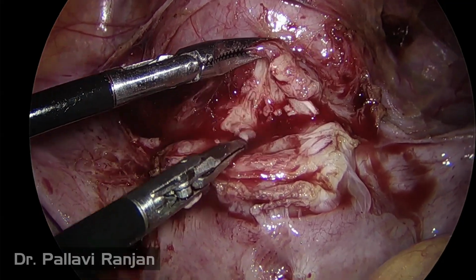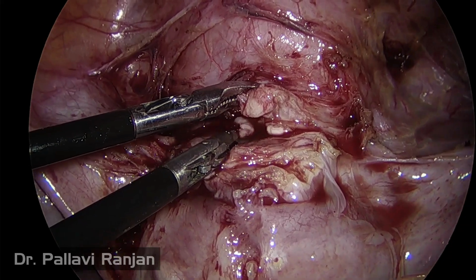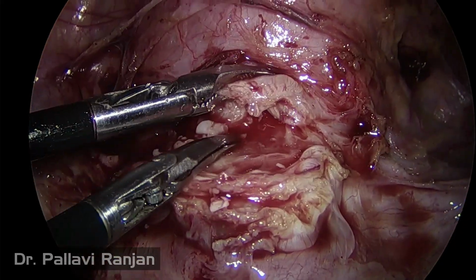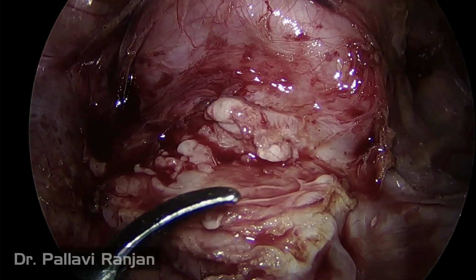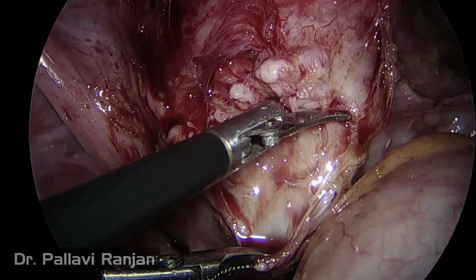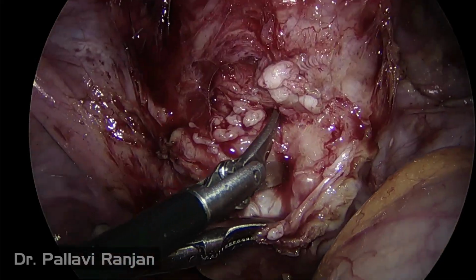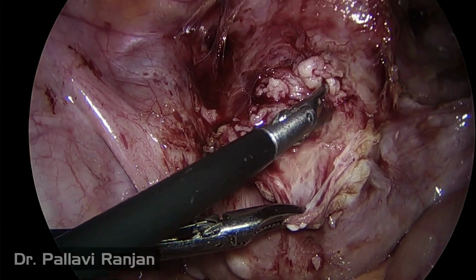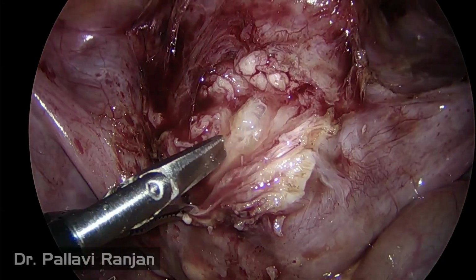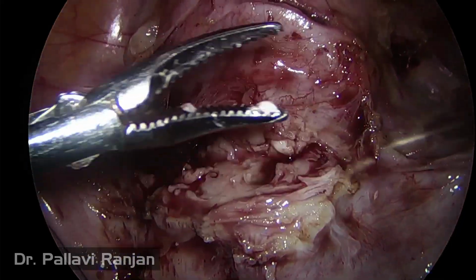So we are using cold scissors to cut through the previous scar, serosa, myometrium to reach up to the sac. And you have to cut adequately so that the sac can be removed and no pieces remain inside the uterus. Once the uterine cavity is reached, you can remove the sac easily. This is the chorionic tissue, and now you can see the sac coming out slowly.